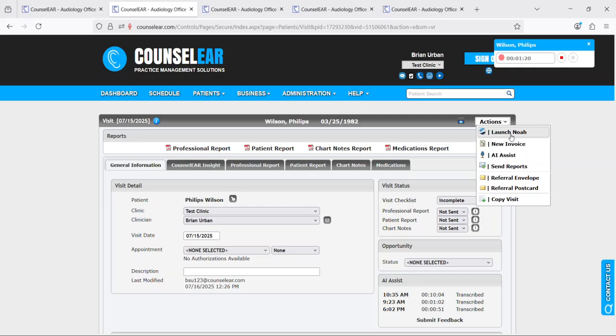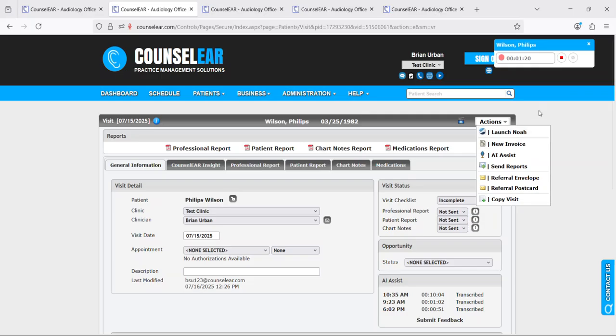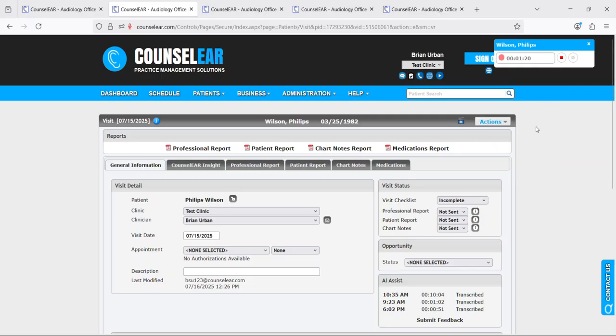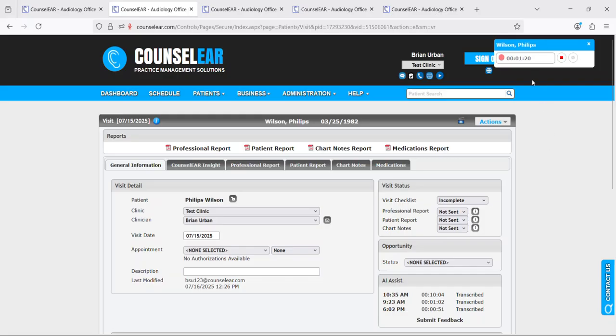Once you finish your testing, you want to send that test data from NOAH into Counselor. You would use the Counselor Synergy module once again like normal. But it's important to note that when you do that, Counselor will open in a separate tab. Make sure you keep this original tab open because that's where this session lives.